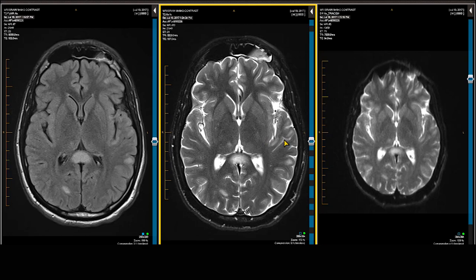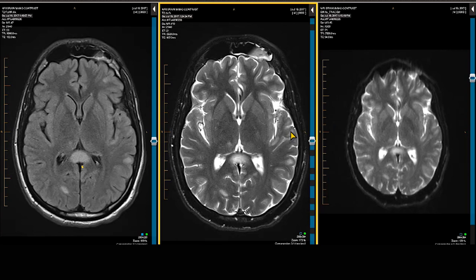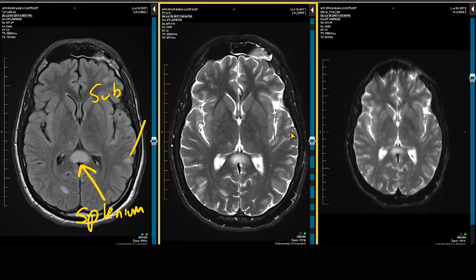Looking at the supratentorial region, we have a large area of demyelination in the splenium of the corpus callosum. We have white matter lesions that are subcortical or juxtacortical, and we have demyelination occurring in a periventricular region.